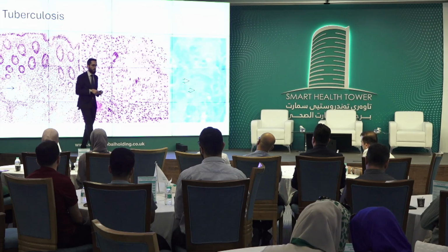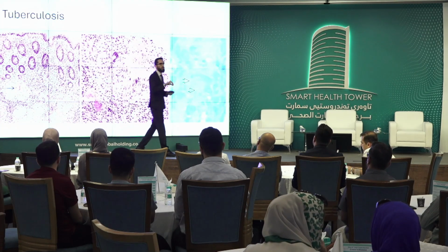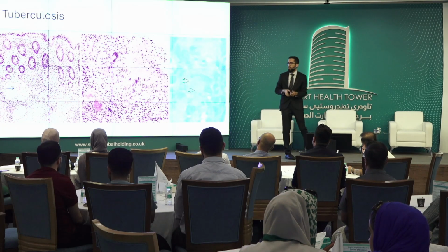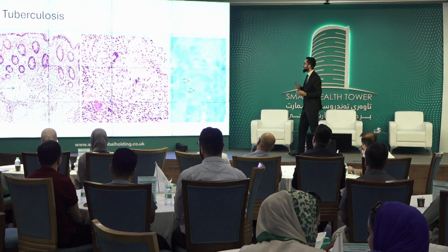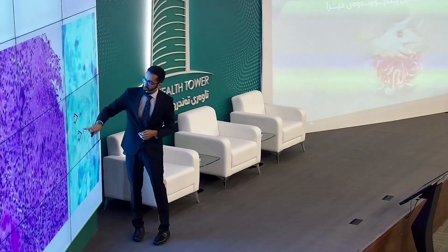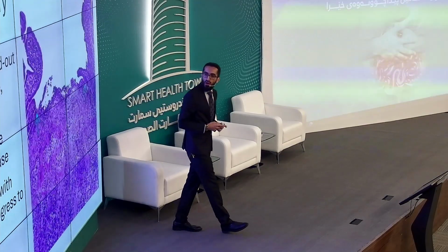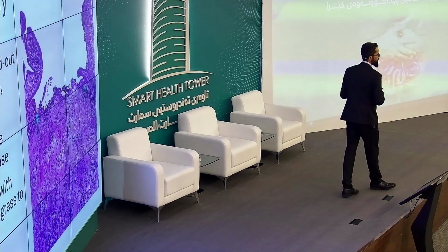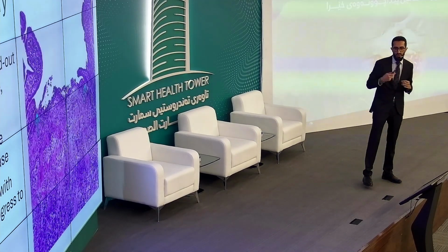We had a case, there were a lot of granulomas just within the endoscopic biopsy, so we were doubtful that it is Crohn because you usually don't see that many granulomas within a biopsy, and we recommended an infectious workup for it. This is an acid-fast stain. You can see these tiny red structures. These are the organisms.